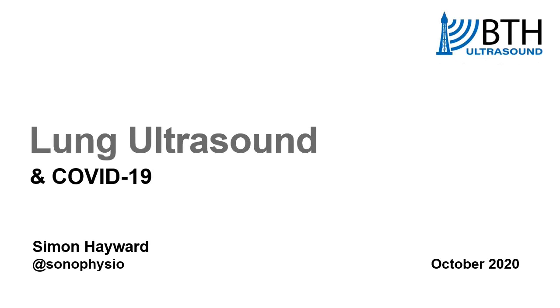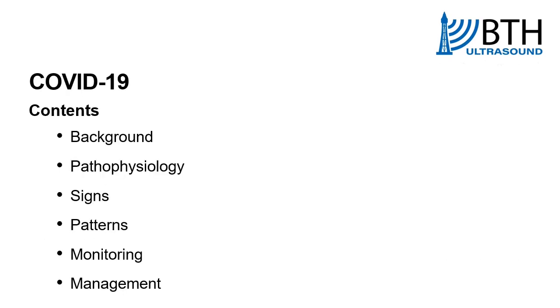My name's Simon Hayward and I'm going to be talking about lung ultrasound in relation to COVID-19. So today we're going to cover a little bit of background about what's been going on with lung ultrasound and COVID-19 recently, some of the pathophysiology, some of the signs that you see with lung ultrasound, and then also how those signs combine to form patterns when you're doing an ultrasound scan, how we can use it to monitor a patient's condition, and then perhaps some information about how lung ultrasound can inform the management of patients who are suffering with COVID-19.